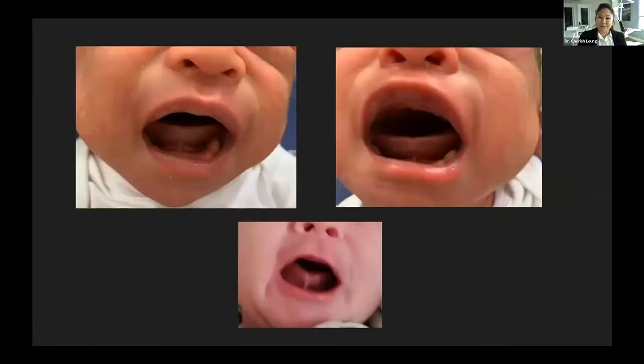These are actually two little babies who I haven't treated yet. I'm seeing them later today as an emergency because they are not growing. This one here, they just sent me photos, and I was like, these are great because they show this baby is fully crying because it was in a video, and you can see his tongue is not even getting halfway up there. So that is a tie. You can see right here the attachment. It actually notches a little right there on the anterior, and it looks really, really tight and short, so most likely we'll be looking at that procedure.